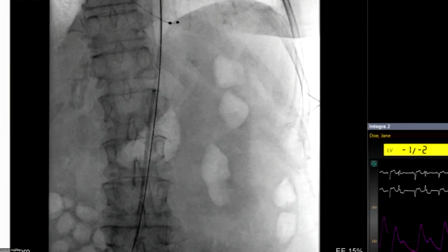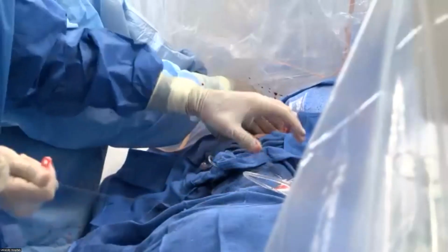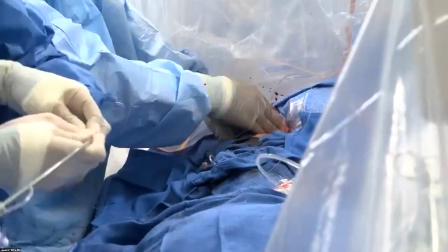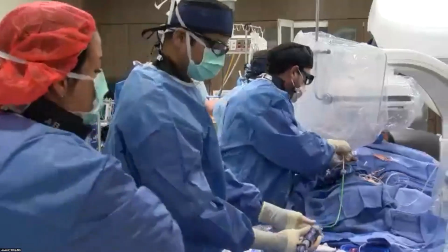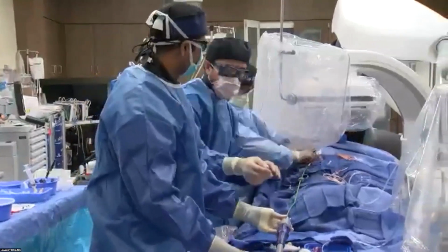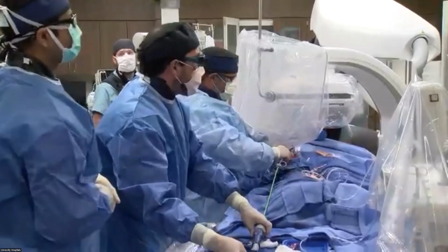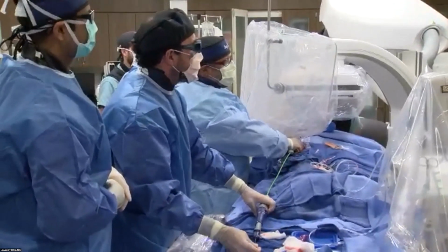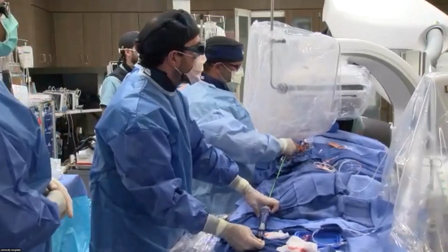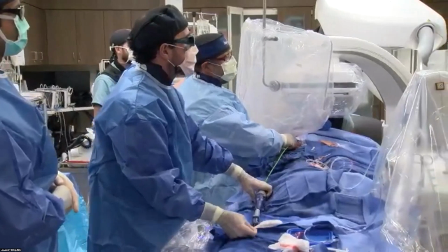We talk about commissural alignment a lot. Does it translate to better hemodynamics in bicuspids? We don't know. Yeah. All right. So here, importantly, we're going to keep the flush port, Flora. Flush port at 3 o'clock. In our paper published in Circulation: Cardiovascular Interventions, when we keep the flush port at 3 o'clock, 96% of the patients that we treated with Evolut had commissural alignment.